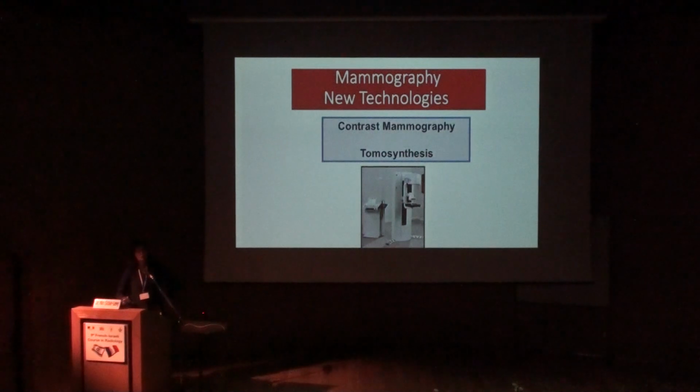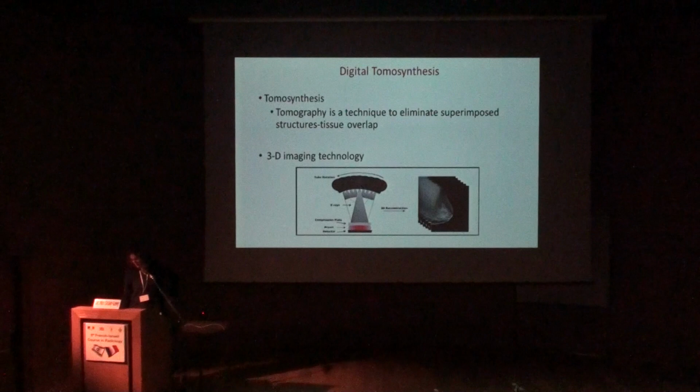So a few words on what are the developments in mammography. Since, as you have seen, dense breast mammography is very limited, in recent years there has been the development of contrast mammography, and the other imaging modality in the mammography field is tomosynthesis.